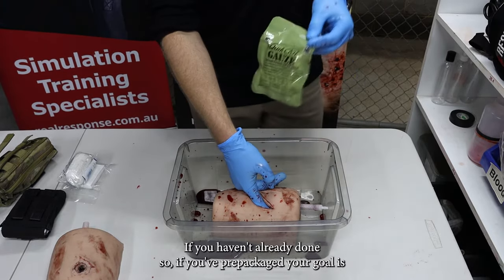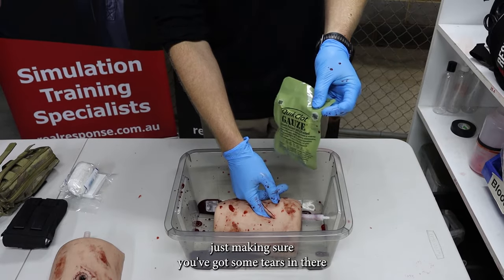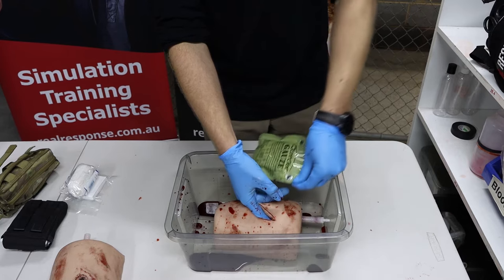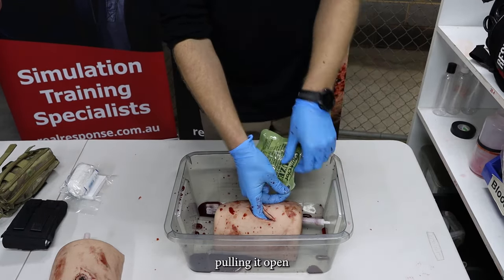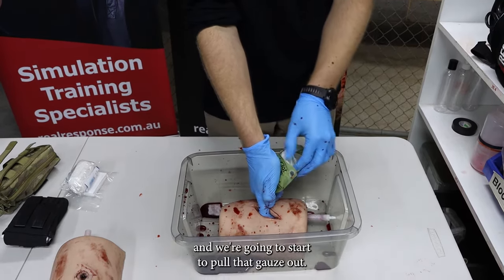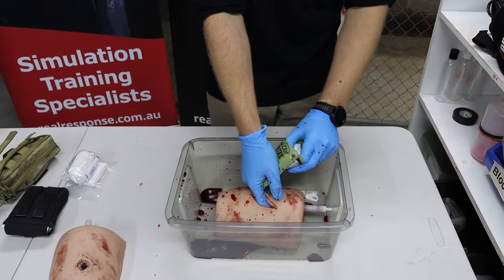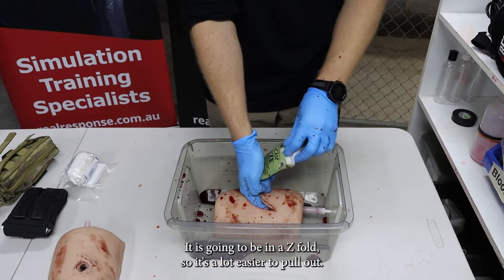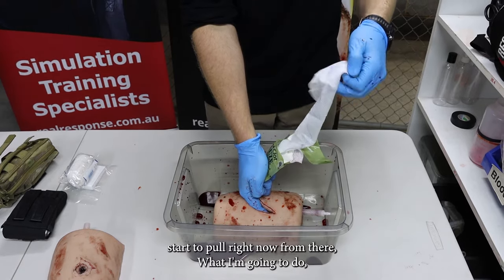If you haven't already done so, if you've pre-packaged your gauze, just making sure you've got some tears in there — that's going to make it a lot easier to pull out with some courtesy tabs. So from there, pulling it open, keeping digital pressure on there, and we're going to start to pull that gauze out. You can rip the whole lot out and then start to pack, or you can keep it in the packet and just start pulling it out. It is in a Z-fold so it's a lot easier to pull out.